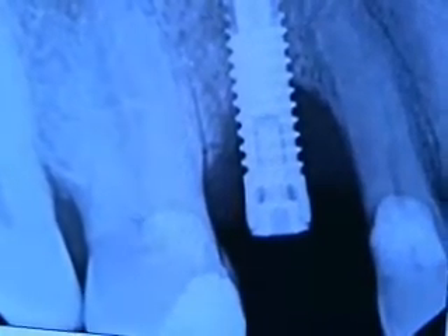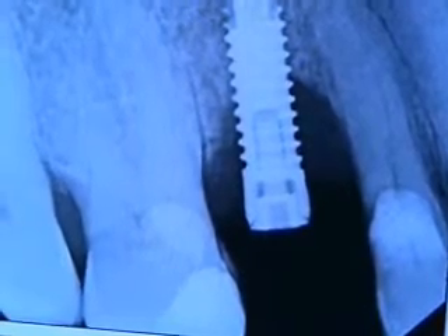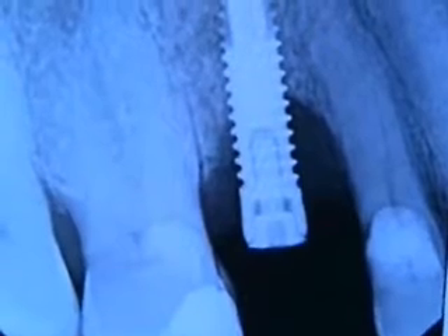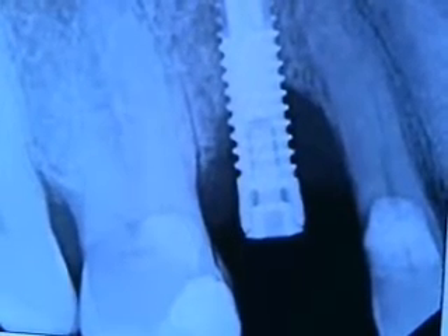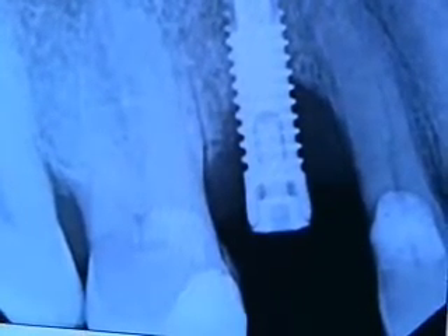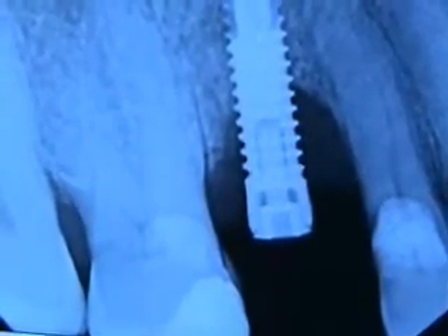Anyway, it got infected and so this patient did lose quite a bit of hard and soft tissue. We'll try to get it back to where we can do an implant. We're not going to get a lot of soft tissue back, but hopefully we'll get a good amount of bone back so we can do the implant later.